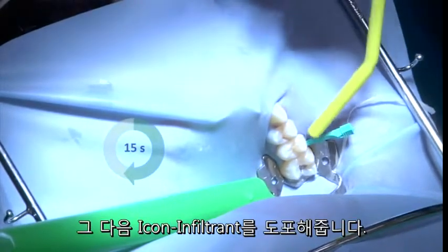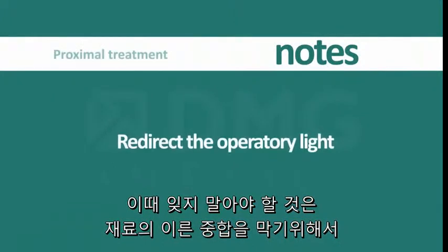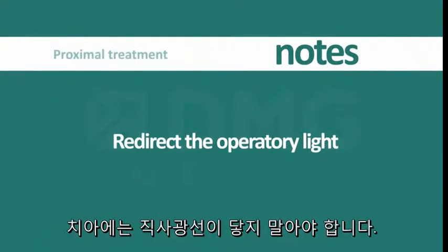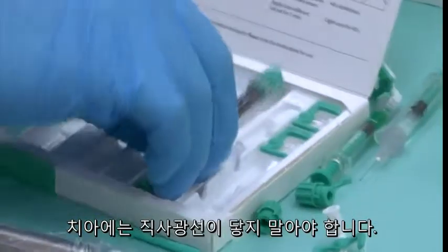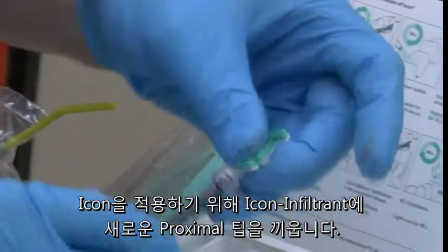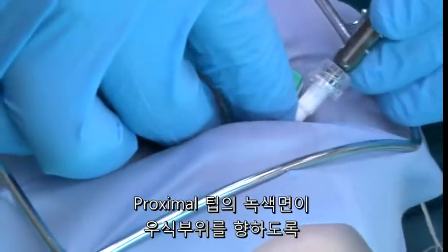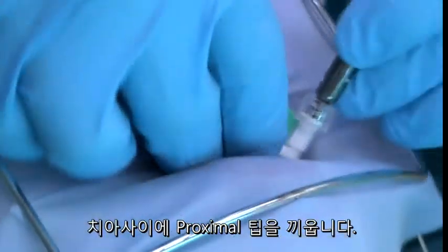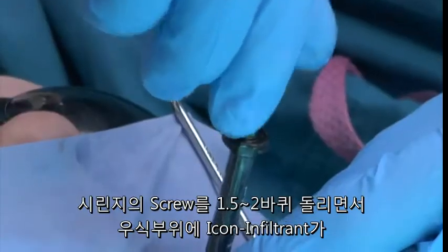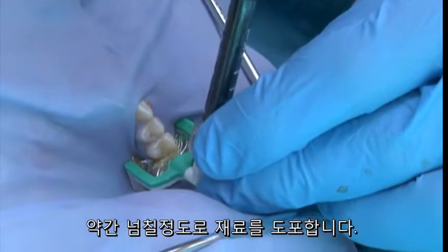The next step is the infiltration. It is recommended at this point to turn off or redirect the operatory light so as not to prematurely cure the material. Apply a fresh proximal tip to the Icon infiltrant syringe and place the applicator into the treatment area with the green side facing toward the lesion.